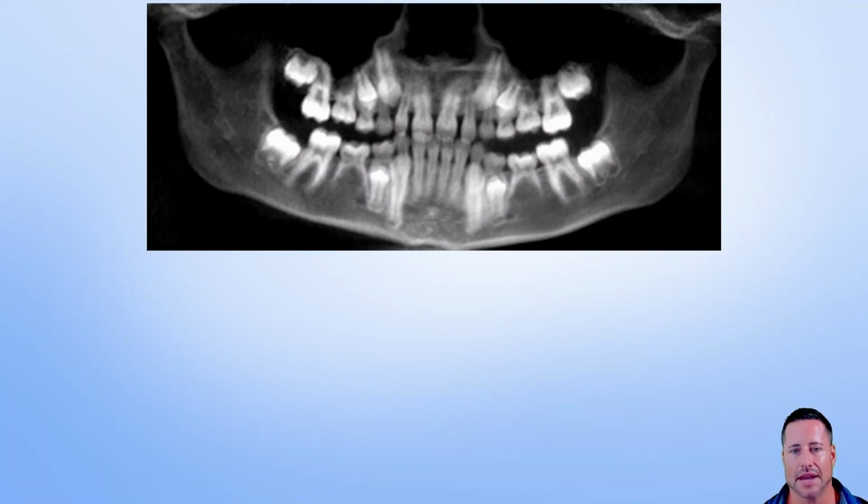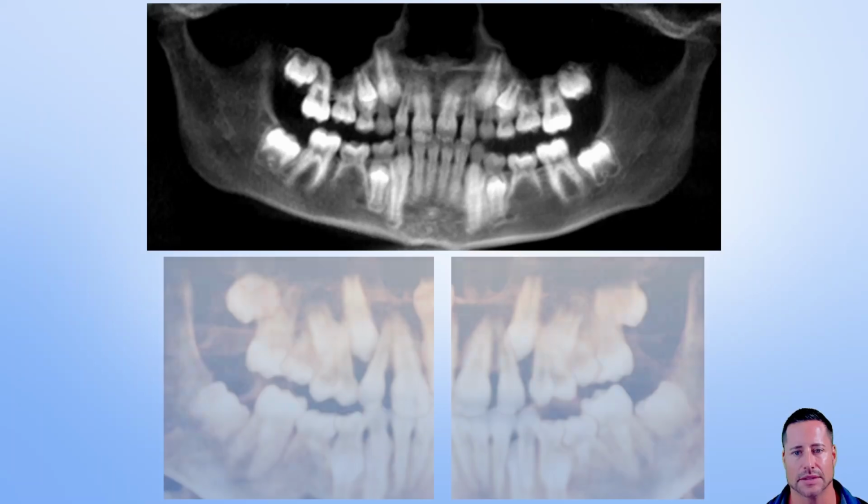Here you can see the canines, a little bit odd looking, and you can see the ankylosed primary molars missing, the lower, or all the 5s, excuse me. So you're already thinking, with the missing teeth, the ankylosed teeth, there's definitely a higher risk of impaction. But it doesn't look like it's horribly out of the ordinary where those permanent canines are descending, the upper canines, but let's take a look.